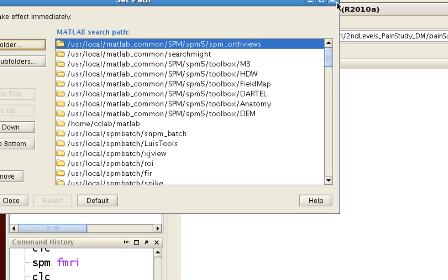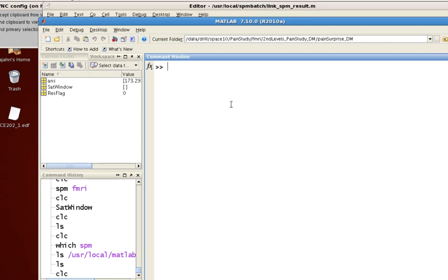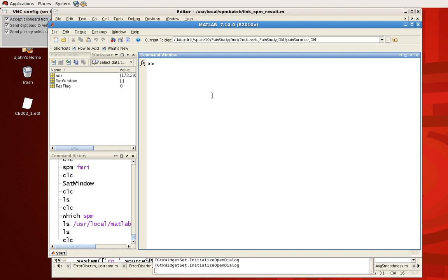So that's where it all is and once you have that and once you have set your path to that directory, you should have already done this. I'm not going to cover it now but there's the tool in MATLAB to set your path if you need to do that. And once you have that set you can go ahead and type in SPM to start it.